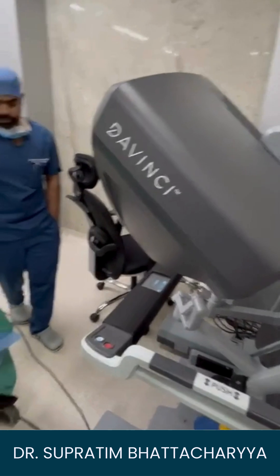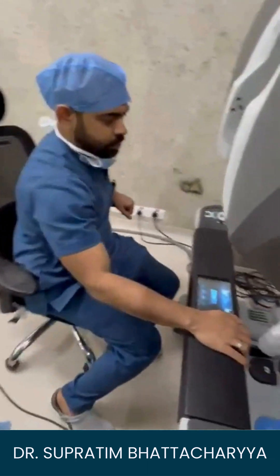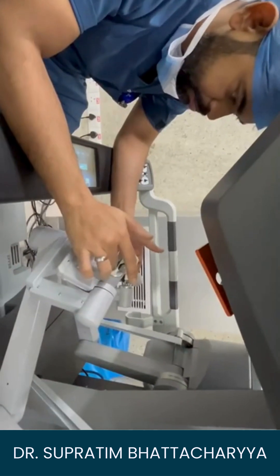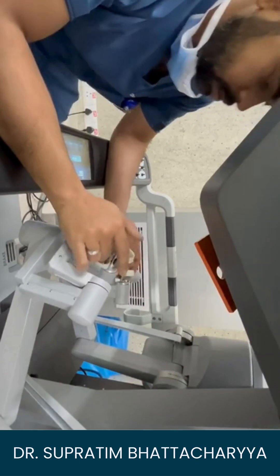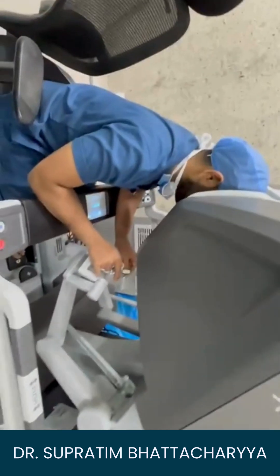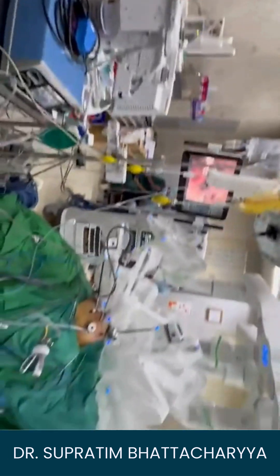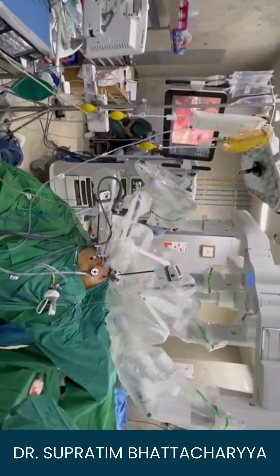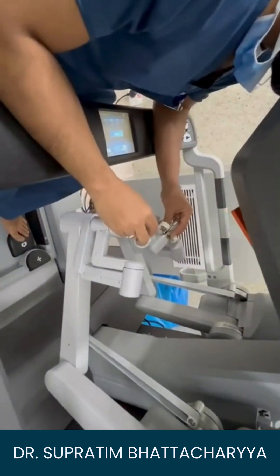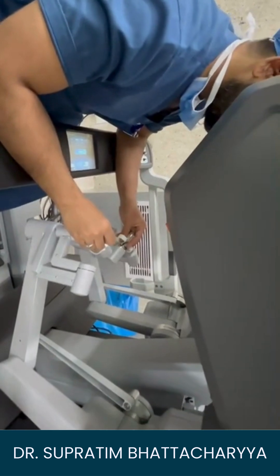This is the console you operate from. The robotic arms are controlled from here. You have some joystick-like controls — you put your fingers inside and look into this viewer. As I move my fingers here like this, the robotic instruments also move inside the patient's abdomen.